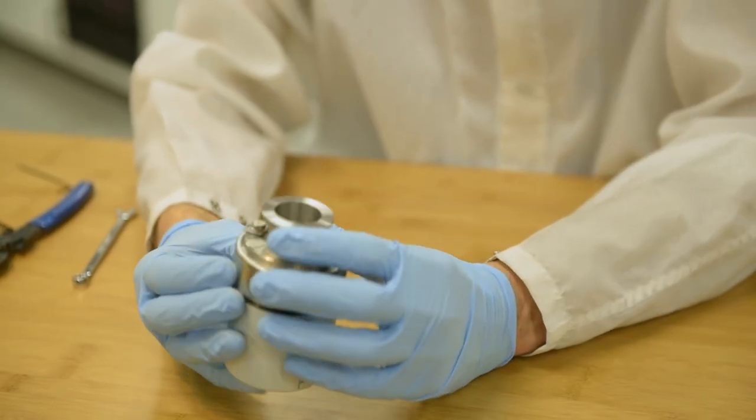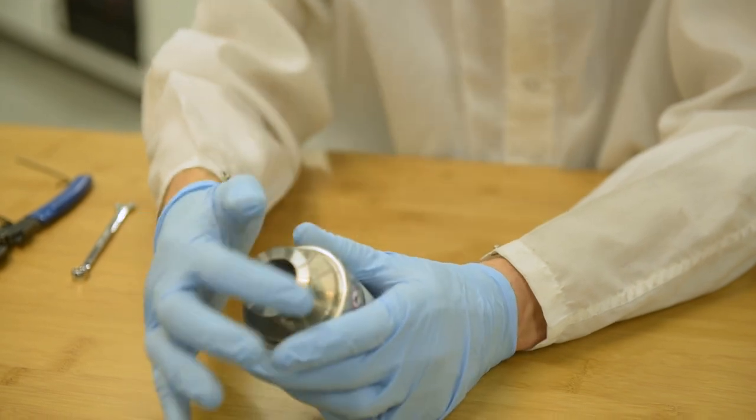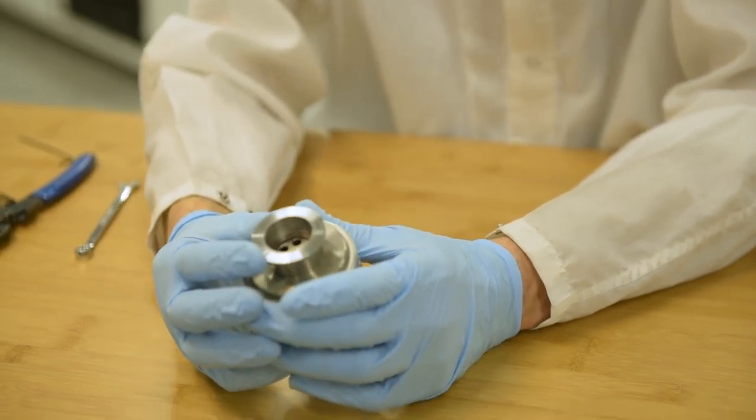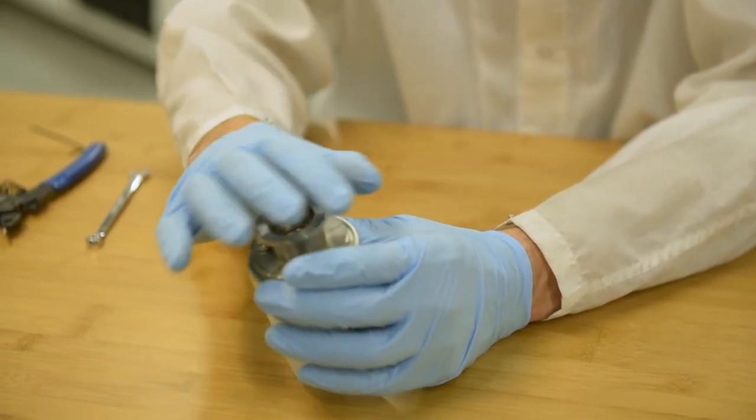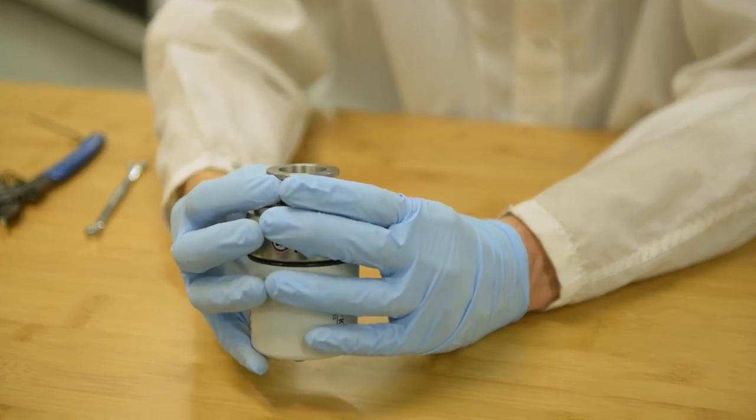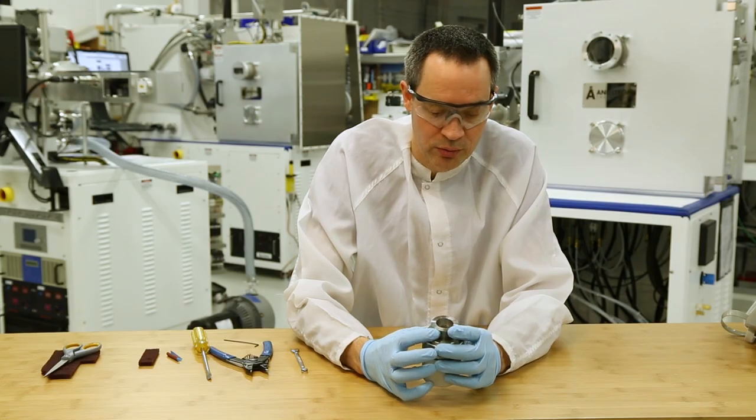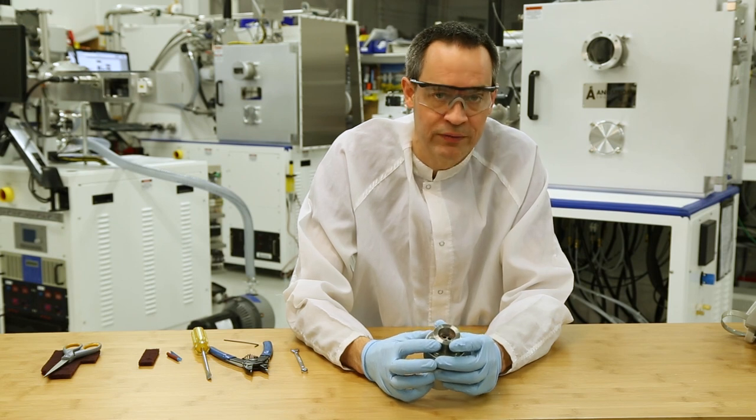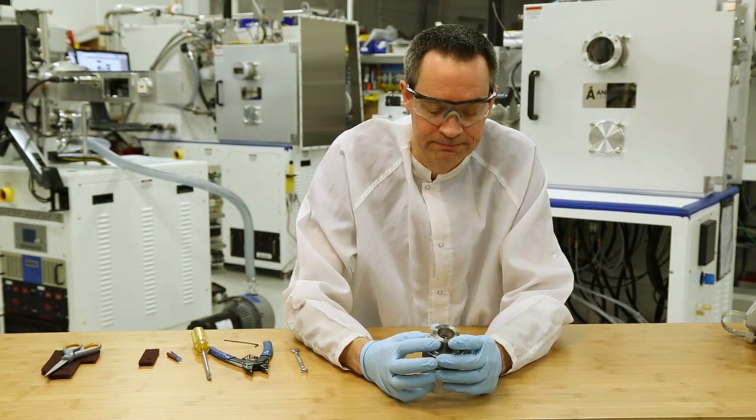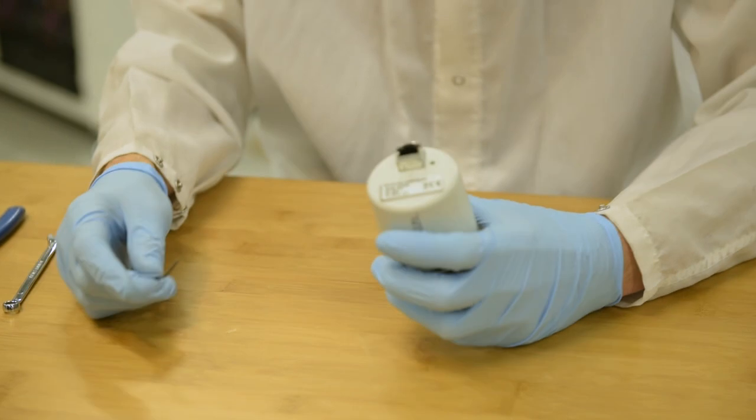Once you've removed the gauge, just be aware while you're working on it of the seal face on the gauge itself. We'll want to make sure we protect that or ensure that we don't scratch or damage that seal face while we're working on the gauge. Let's go ahead and take this gauge apart.